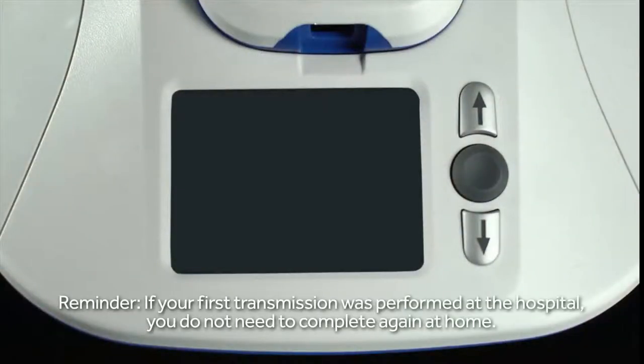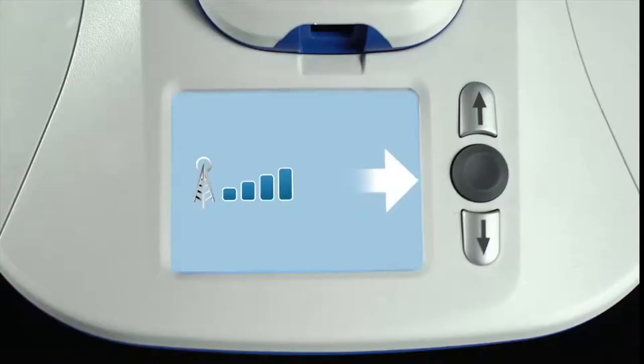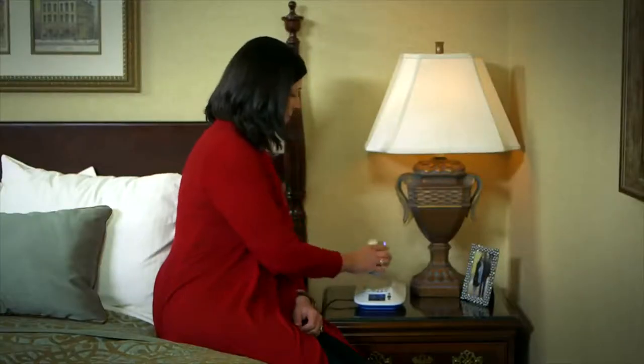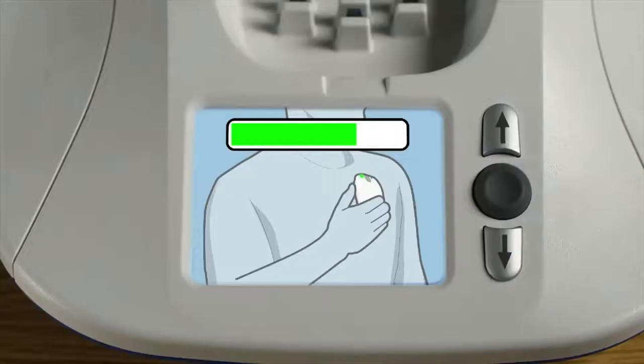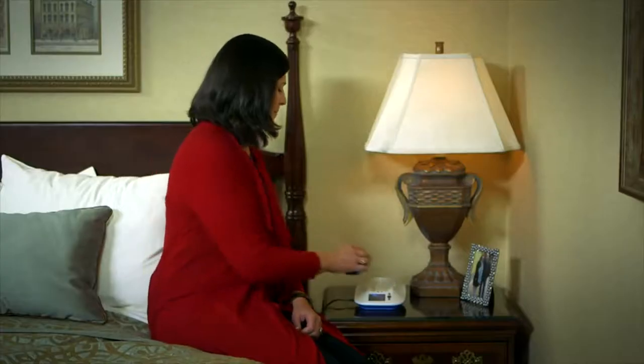Performing a manual transmission is pretty easy, but let's walk through that first setup transmission together. If the monitor screen is dark, begin by pressing the round, gray button just once to wake it up. When you see the screen with a white arrow, you're ready to begin. Now push the gray button once more to begin sending the transmission. Lift the reader from the base and hold it over your Reveal LINQ ICM. The green bar means it's reading information from the Reveal LINQ device. When the reading is complete, the monitor will make two short tones and the display screen will show you that you can return the reader to the base.